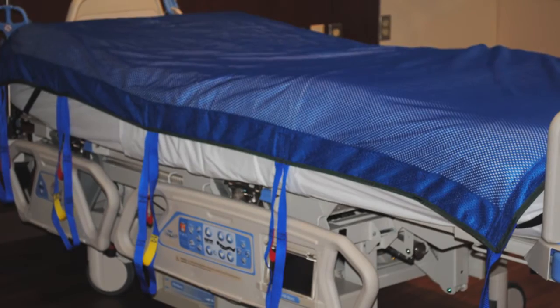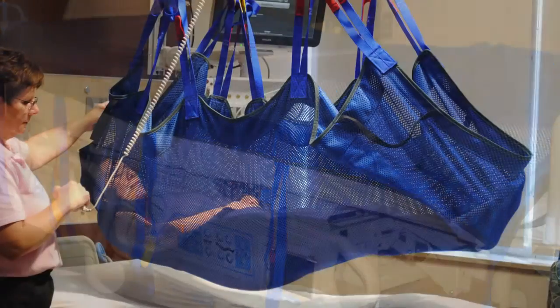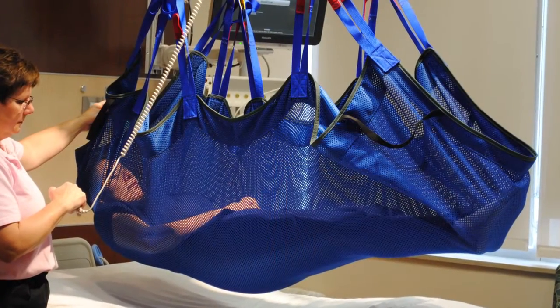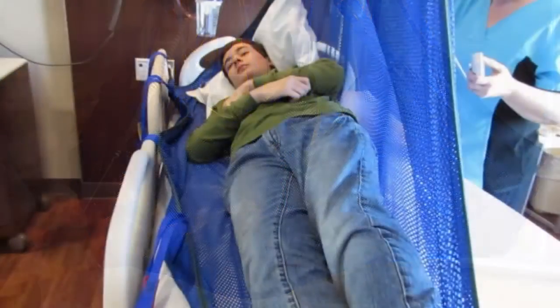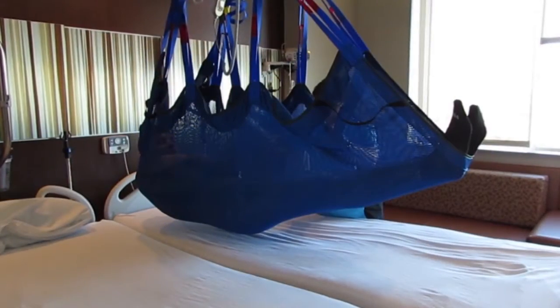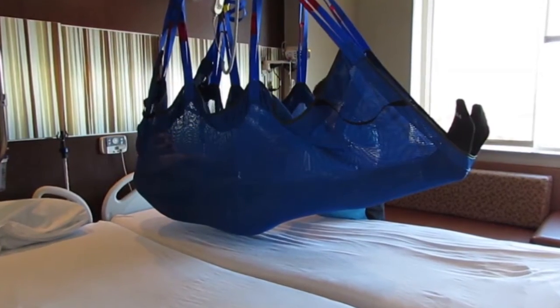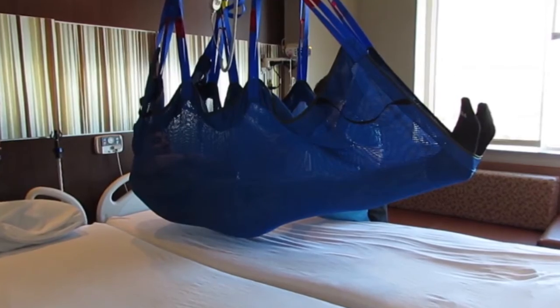This is the Tolos Repositioning Sling. It is used for repositioning a patient in the bed, rolling a patient from side to side, lateral transfers to another surface, as well as lifting someone from the floor.